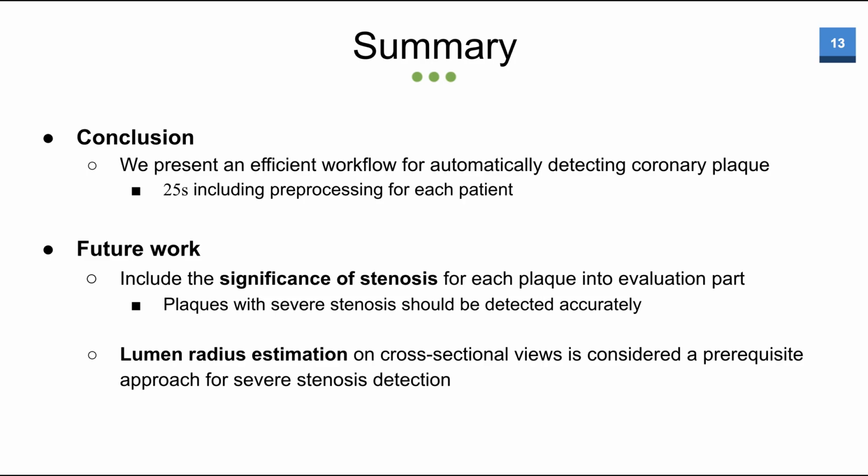In the next step, we aim to include the significance of stenosis for each plaque in the training and evaluation of the model. And we also consider lumen radius estimation on the cross-sectional planes as a valuable approach for severe stenosis detection.